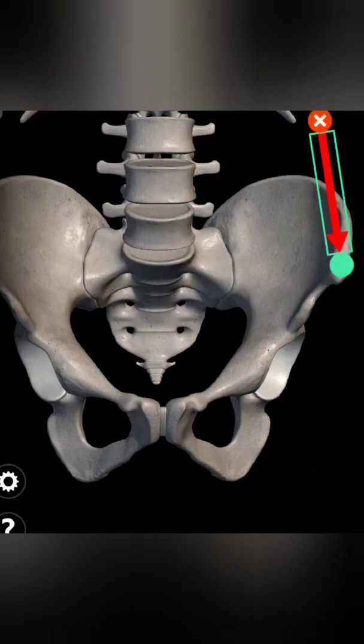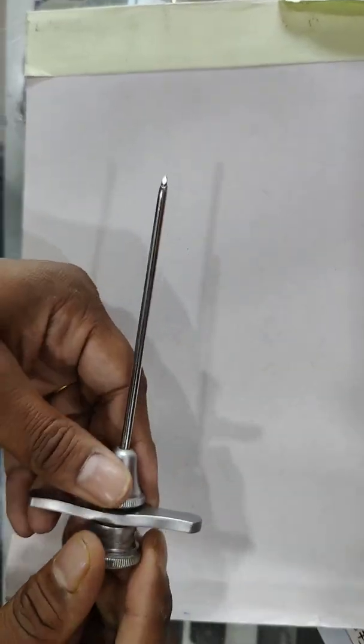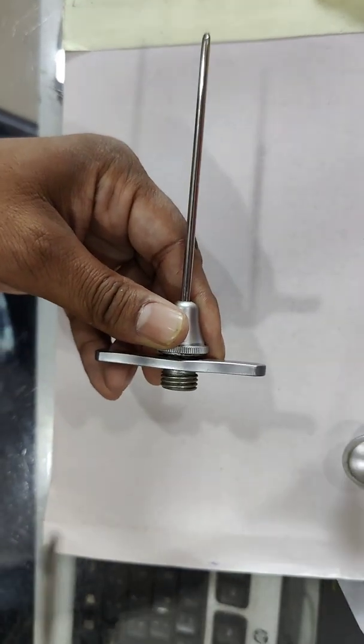This is the site of ASIS. After giving local anesthesia, just insert a Jamshedhi needle at the top of the ASIS and insert inside about half centimeter. This is the video showing the Jamshedhi needle and its parts.